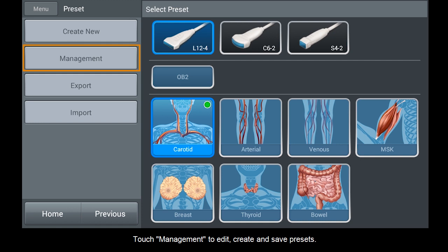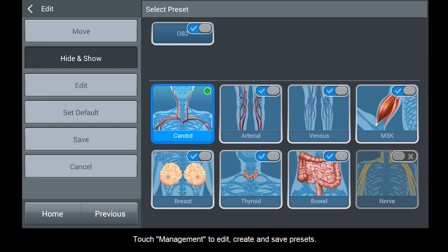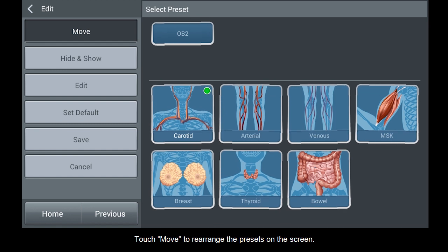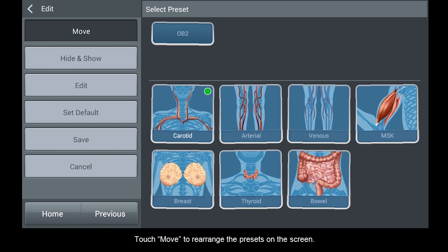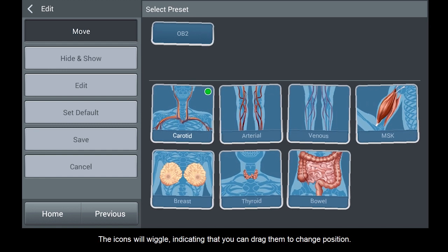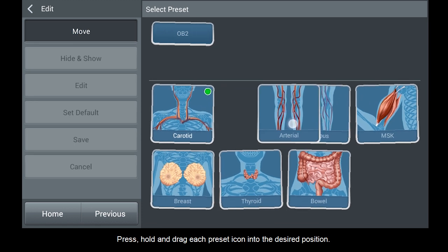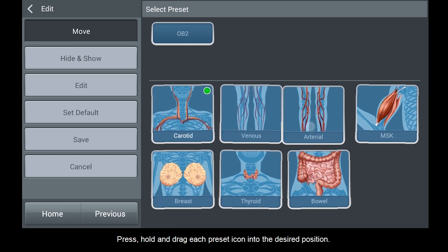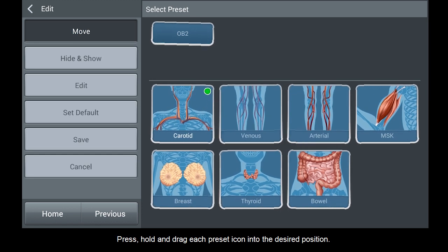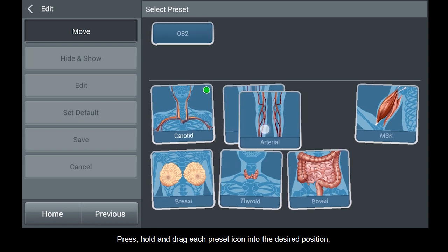Touch Management to edit, create, and save presets. Touch Move to rearrange the presets on the screen. The icons will wiggle, indicating that you can drag them to change position. Press, hold, and drag each preset icon into the desired position.